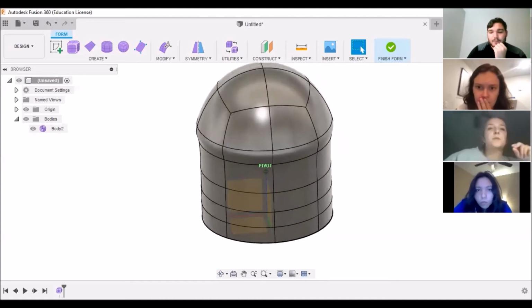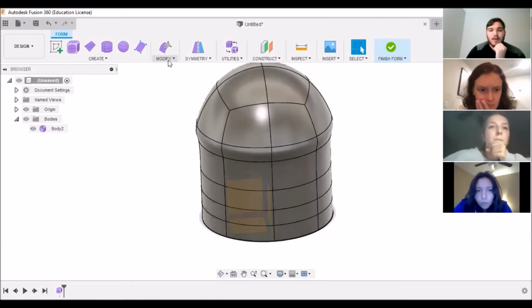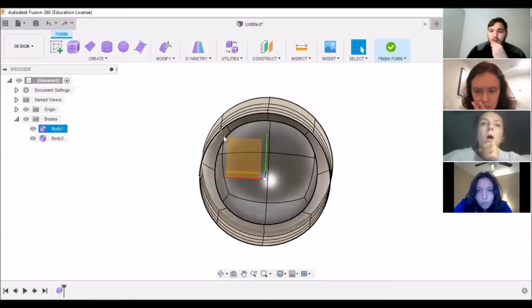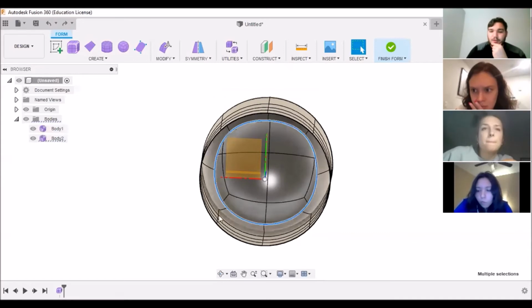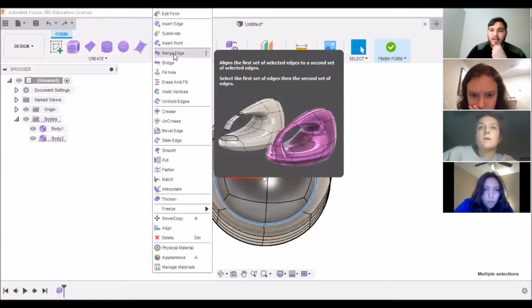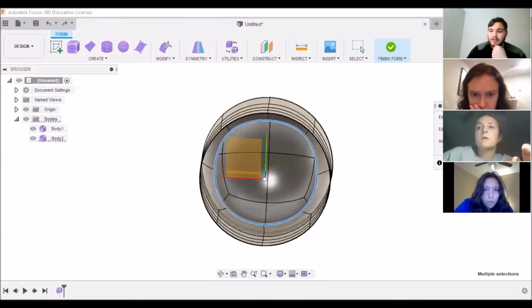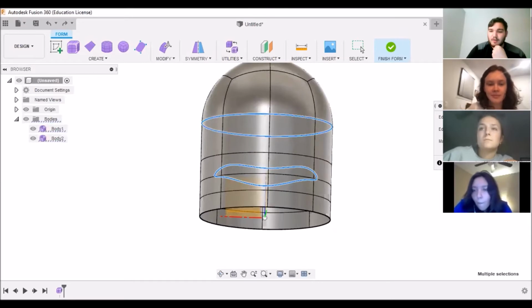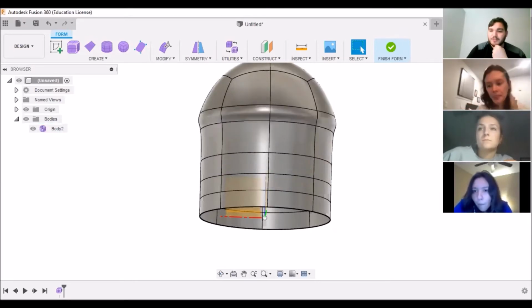Wait, which button did you use to do that? Yeah, so let me go back. If you delete some faces, you can double click on one of the edges, so it highlights the entire edge. Go to your top bar, do the modify scroll down, go to merge edge, which keeps your highlighted edge. You need to change to edge group 2. Click on that arrow, and then double click the top of the cylinder. Press OK, and then it merges those edges.